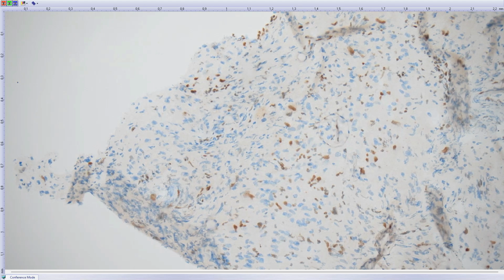So in this case, it's not that piloid looking, so the histomorphology is very non-specific, and you should think about the lesion in, let's say, a typical clinical setting: a posterior fossa lesion, adult case, ATRX negative tumor. You cannot really classify by other immunos or genetics. You should think about this tumor type and send it for methylation profiling. Okay.